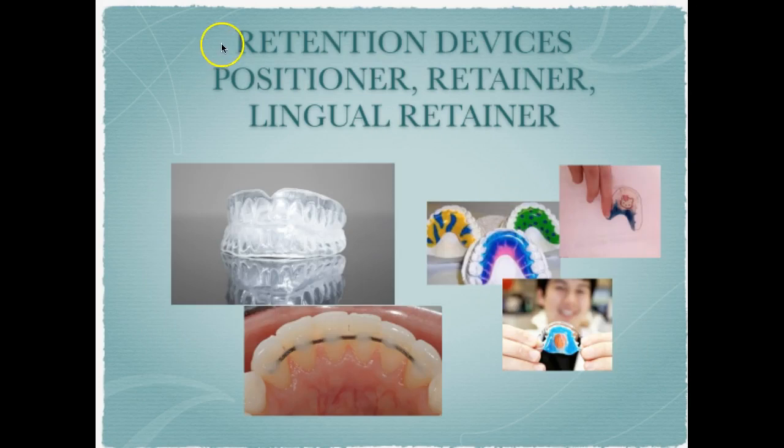Post-orthodontic treatment, there are some retention devices. One of them is called a positioner, in which an impression is made after the removal of the corrective fixed appliances, and the patient would wear this positioner that holds the maxillary and mandibular arch together in order to keep tension on the teeth and retain them in their position.